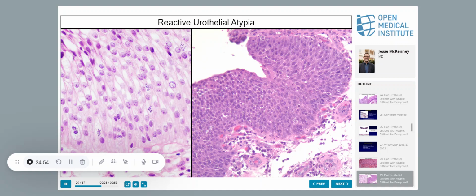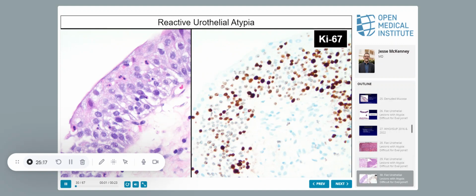This is another example. These are the ones that are harder because they look darker, but the chromatin's still relatively fine. In some areas, you can still see the grooves. And if you compared them to a lymphocyte nucleus, let's take that one. Maybe you get 3. These cells are actually quite small. Here's another one. You can see the neutrophils mixed in.